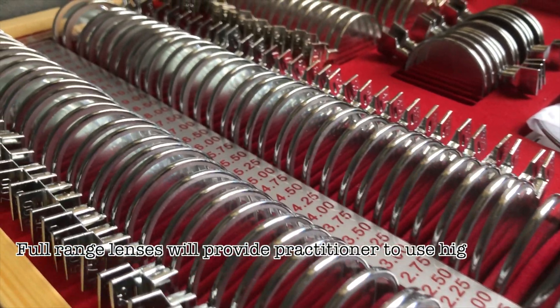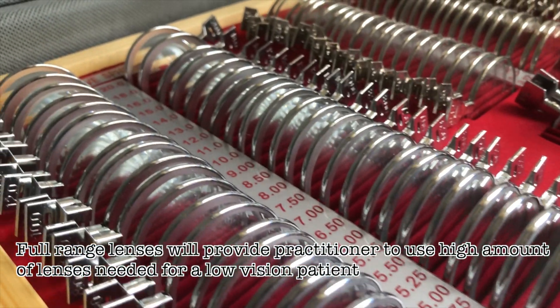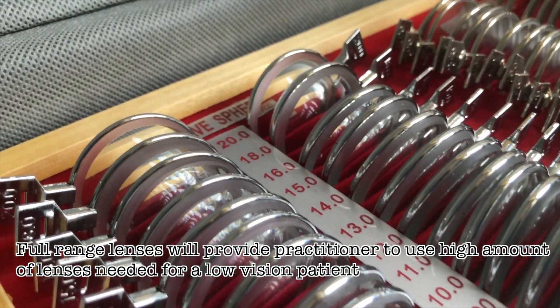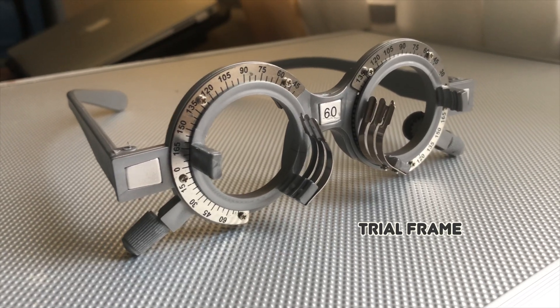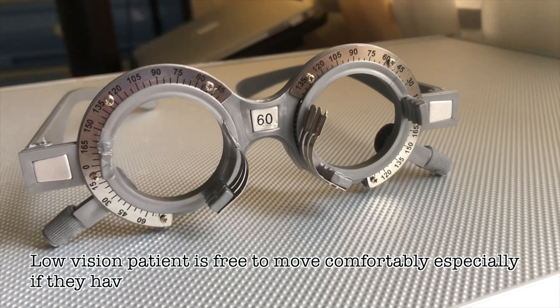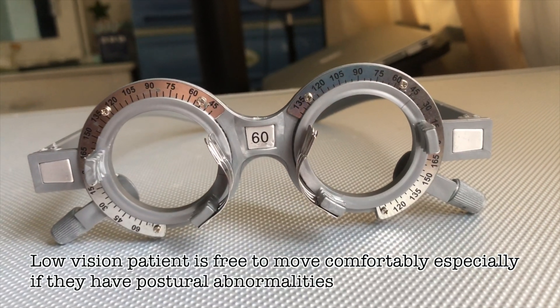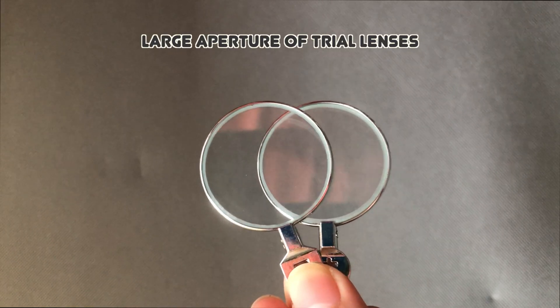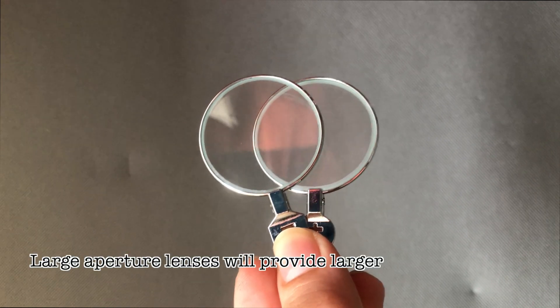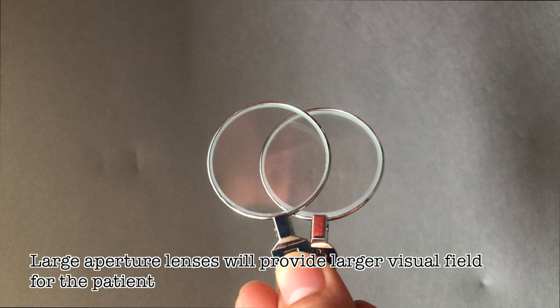Full range lenses will provide the practitioner the ability to use high amounts of lens power needed for a low vision patient. The low vision patient is free to move comfortably, especially if they have postural abnormalities. Large aperture lenses will provide a larger visual field for the patient.